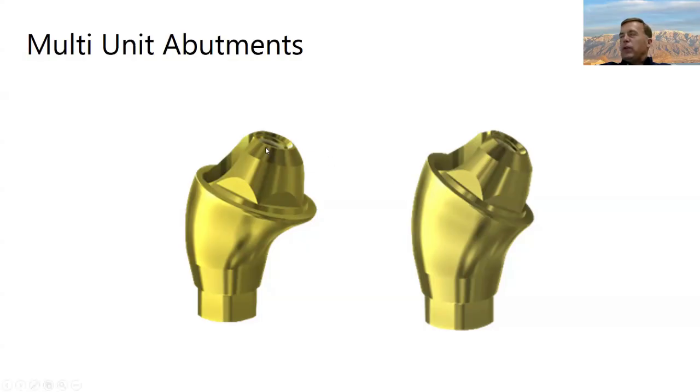In general, most of you know this, but as you're selecting the angle on your MUAs, the point of the way you choose the angle and rotate it is so that this axis is as parallel as possible on all the different sites, regardless of how much divergence there is between the implants. Different companies have different contours here. A slimmer contour tends to seat better with less bone profiling, which can be really nice on the day of surgery. And then last but not least, this is important.